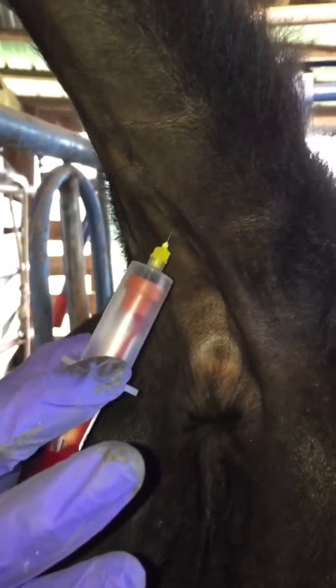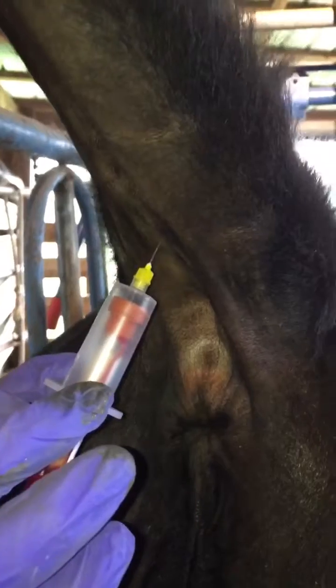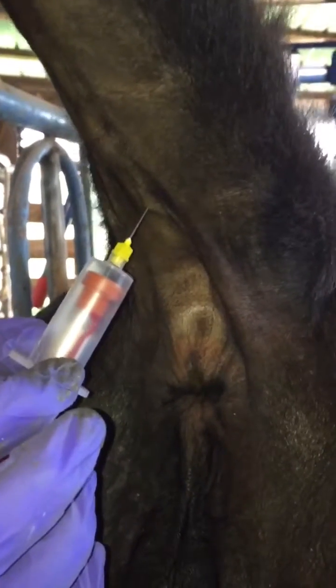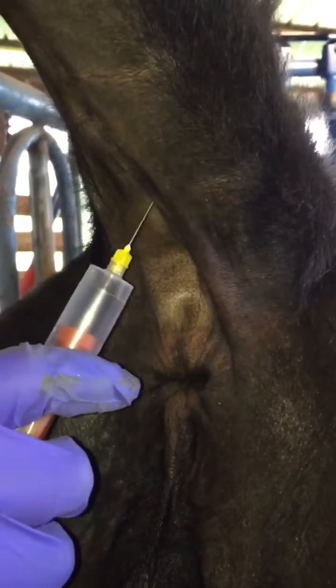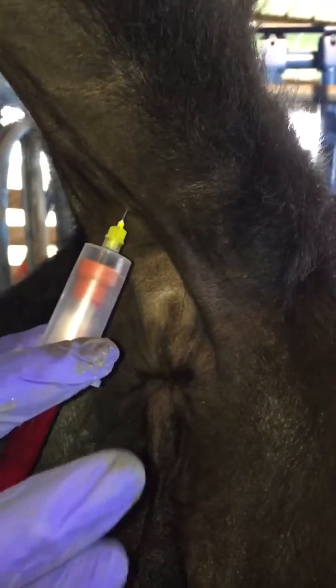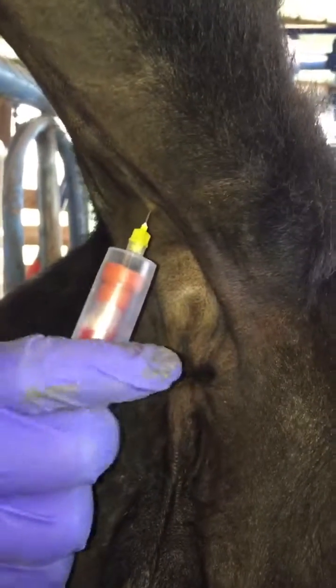I've missed it just a little bit, so try again. Remove your vacuum container — you'll lose your vacuum. Go in to the bone and then back off just a touch. There it is. Alright, you can pop it loose and remove, and there you go.